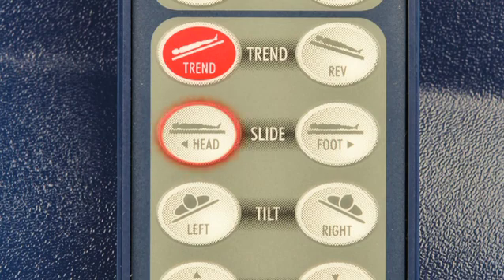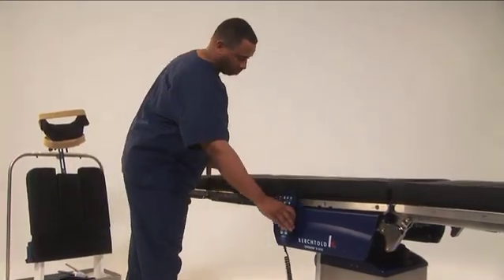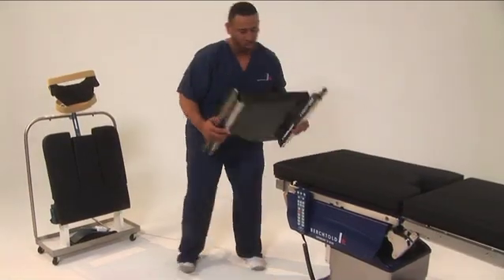To use the shoulder chair, use the slide button on the hand pendant to slide the table all the way towards the head. With the table in the locked position, remove the head section and the back section.